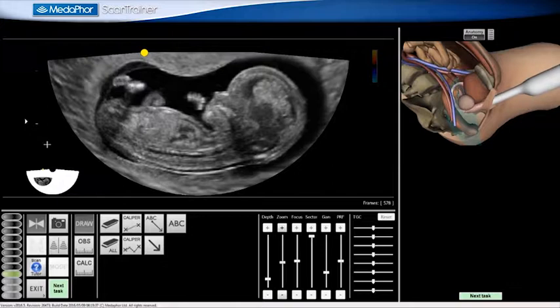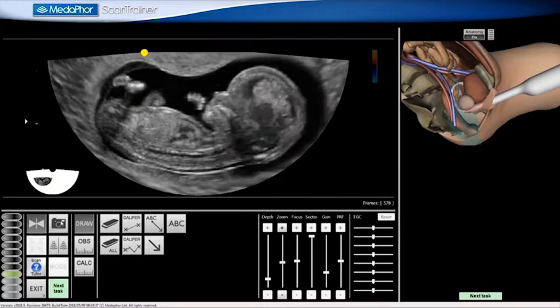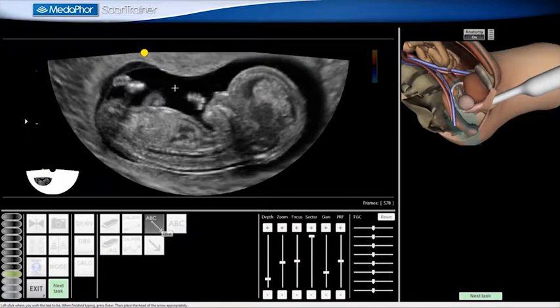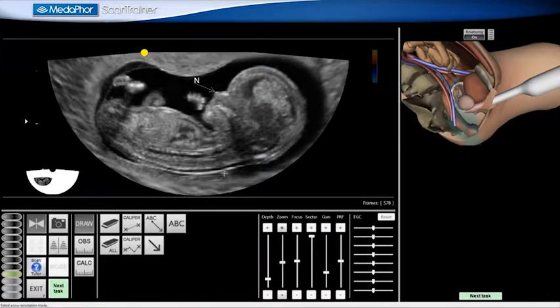I then capture my image and keep the ultrasound image frozen, and then click Next. I now label the nasal tip using the ABC labeling tool. I then keep the ultrasound image frozen and click Next.